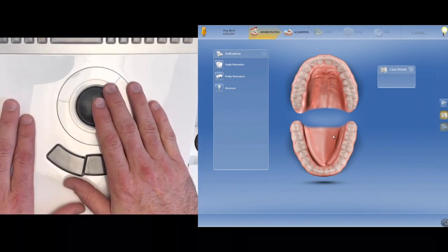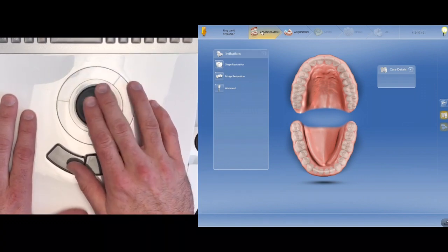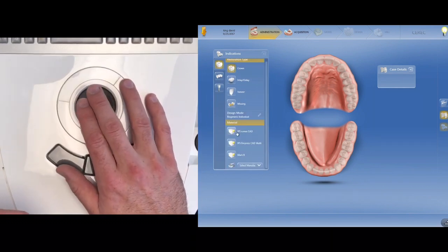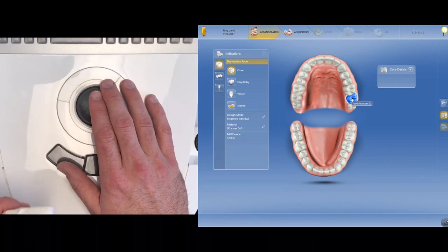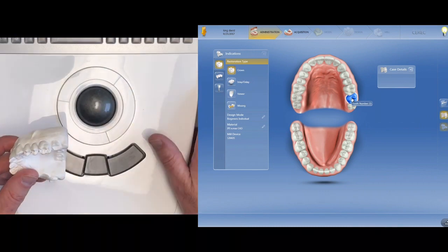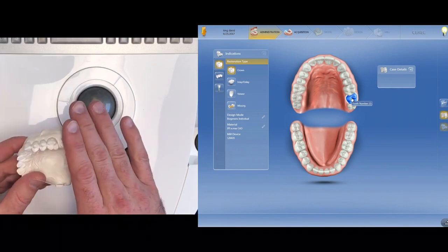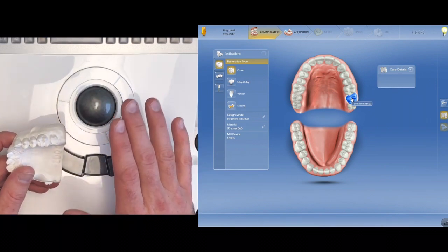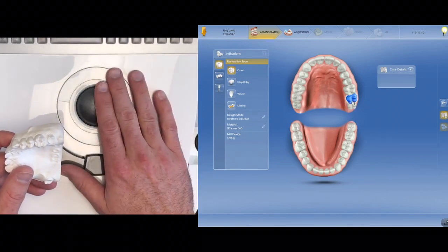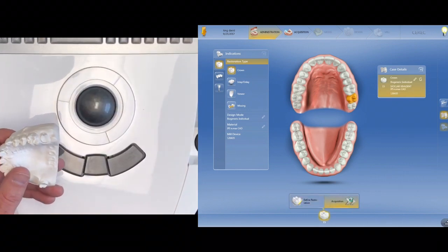So here we have the main screen. I've already got myself pulled up as the patient. I'm going to add a single restoration, crown, biogeneric individual. We're going to use Emax, and I'm going to select tooth number 15. I have a model here. I'm just going to scan the upper. I'll show you a little bit about how I like to scan and the positioning. We'll go through some basics, and really what I'm trying to focus on right now is hand position and how to hold the camera. So we're going to go ahead and click number 15, and I will hit next. We'll get to the imaging screen.